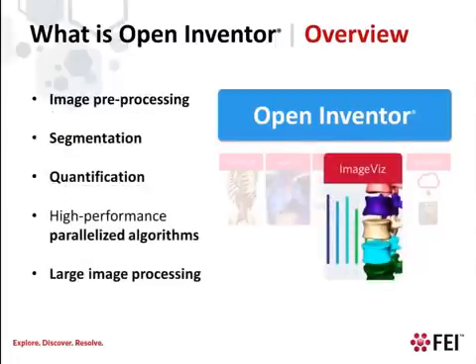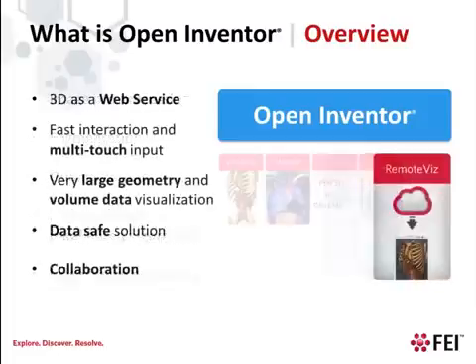The ImageViz extension provides advanced 2D and 3D image processing and analysis capabilities for medical imaging software applications. These capabilities cover the whole application workflow, from image filtering and pre-processing through segmentation and data analysis. The Remote Viz extension enables you to add server-based 3D interaction and visualization into web-based applications that can display on any device with an HTML5-enabled web browser.